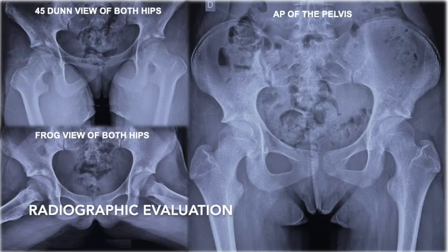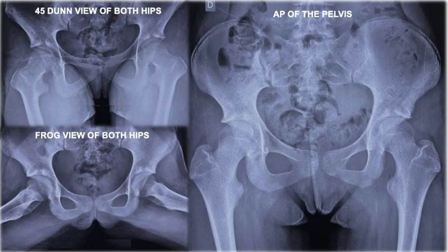The present video presents a case of a patient with increased femoral anteversion. X-rays are usually evaluated before clinical examination of the patient. These are the X-rays of an adolescent patient. Note in the right image the prominent lesser trochanter and increased valgus, both suggestive of increased femoral anteversion.